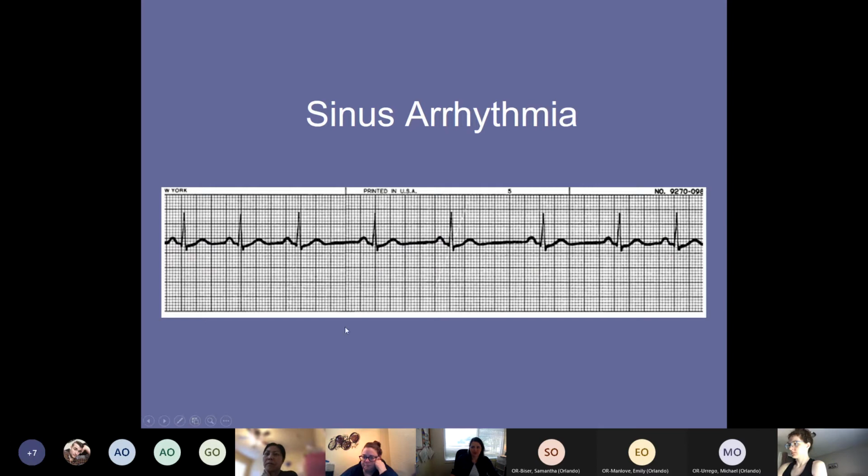All right, sinus arrhythmia. This is a very, very common thing, and it's related to breathing. When you inhale, the heart rate goes up. When you exhale, the heart rate goes down. It's just changes in vagal tone during respiration. If you breathe out really slow, it slows your heart rate, right? So that's what's happening here. But basically, it's a sinus rhythm because we still have a P for every QRS. Everything looks beautiful here, except these just don't march out exactly. Okay. A few of us probably have this right now. No biggie whatsoever.